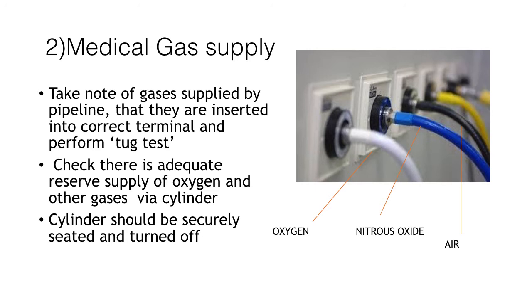The pipelines are connected to the anaesthetic machine via a non-interchangeable screw thread connector. When checking the machine, you should check that the colours match up at the Schrader valve and the pipeline, and you should also perform the tug test — ensuring that when you tug the pipeline, it is securely seated in the Schrader valve at the wall. In addition to the pipeline, you should also check there is an adequate reserve supply of oxygen and other gases available via cylinders on the back of the anaesthetic machine. These spare cylinders should be full, securely seated, and also turned off so they are not leaking.